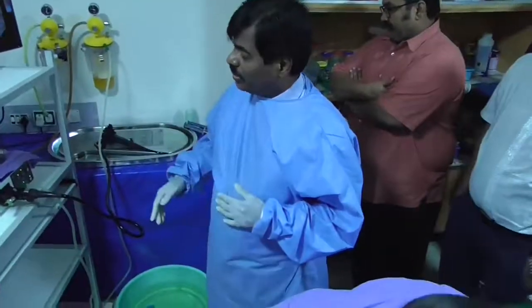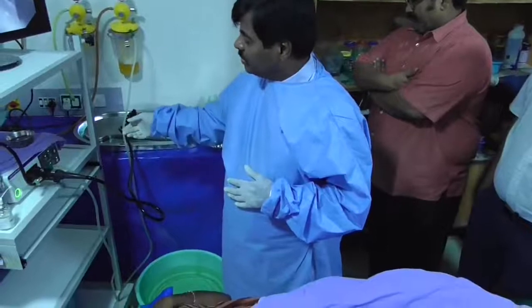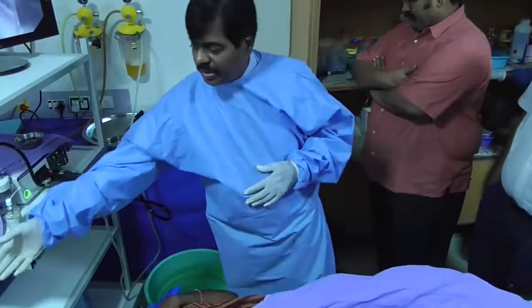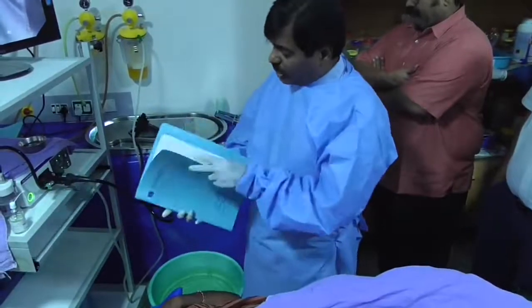After soaking in disinfectant for 10 minutes, talk to the patient, get the report done, and give the report to the patient.